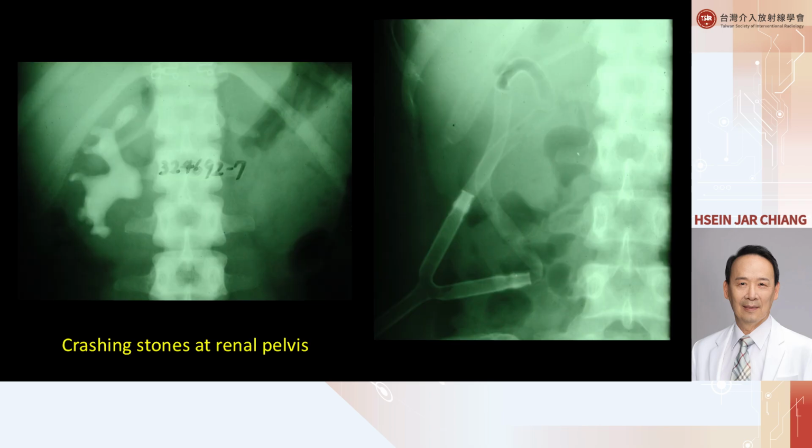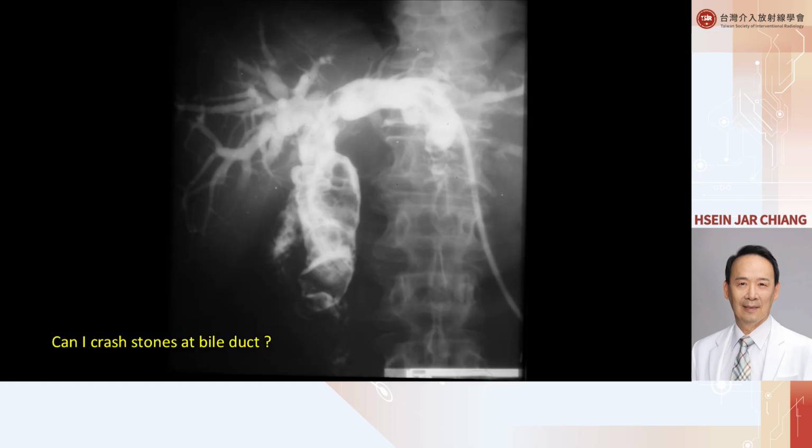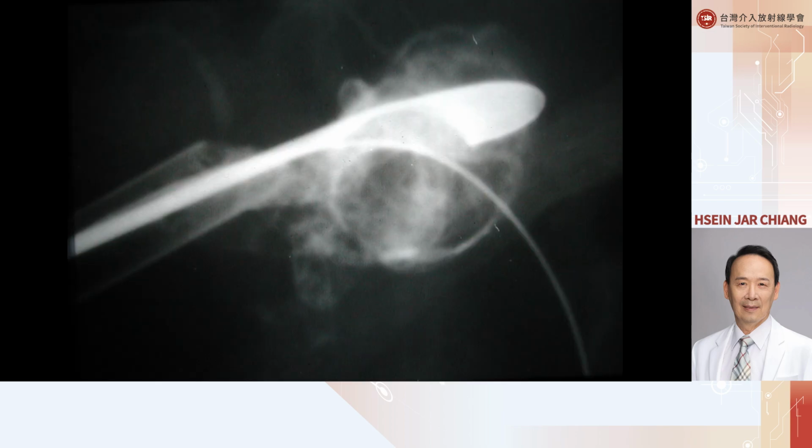In the early 1980s, a urologist and I performed the first PCN lithotripsy in Taiwan. At that time, we crushed stones in the renal pelvis and removed all stone fragments to clean up all stones. I thought, how about the bile duct stone? Can we crush these stones in the bile duct and remove all the fragments? So I tried to borrow the curettage spoon from the operation room, but this is a metallic spoon. It's very difficult to negotiate the curve of the bile duct, so it's only limited to some small cases.